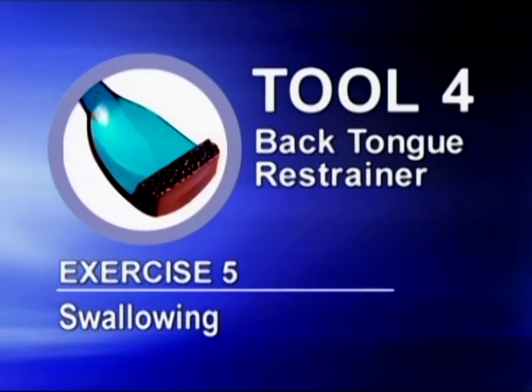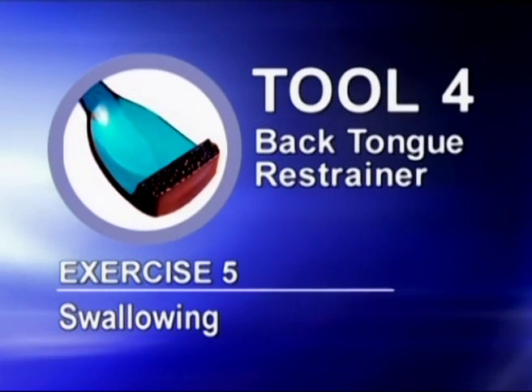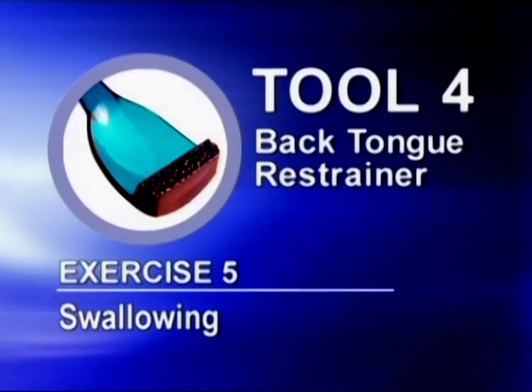The goal of exercise protocol 5 is accuracy of swallowing. Use water to moisten the mouth. Place tool number 4 on the palate behind the front teeth. Bite teeth on the handle, close lips, and swallow.